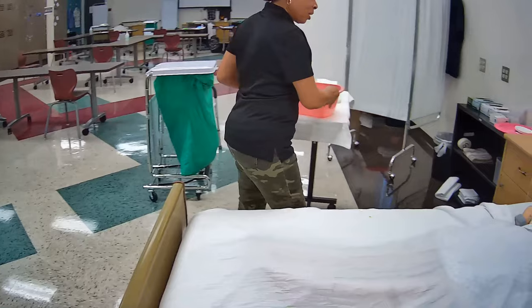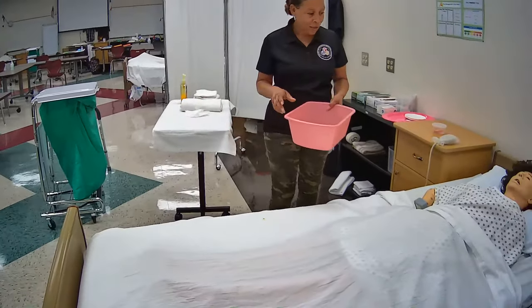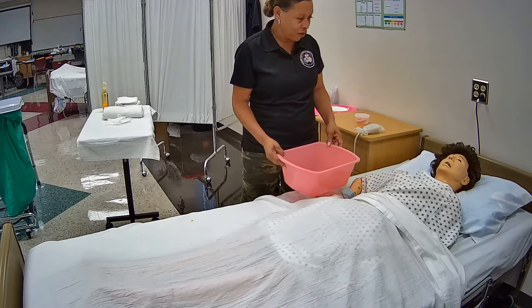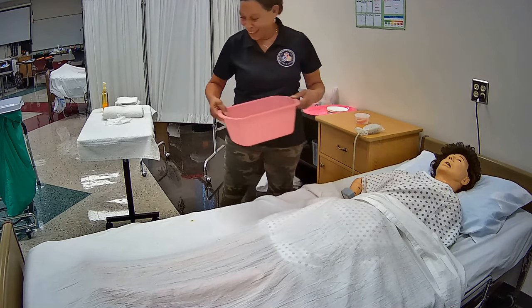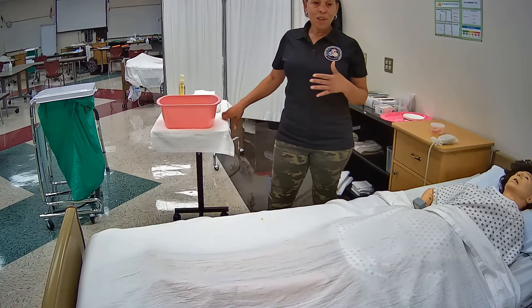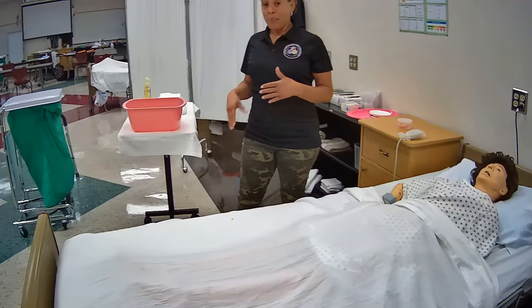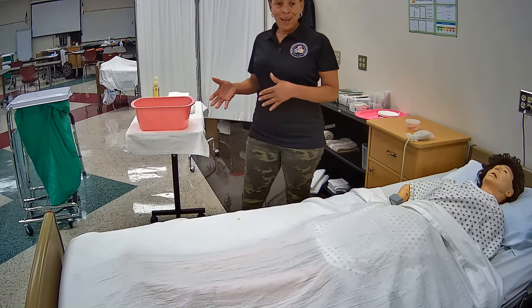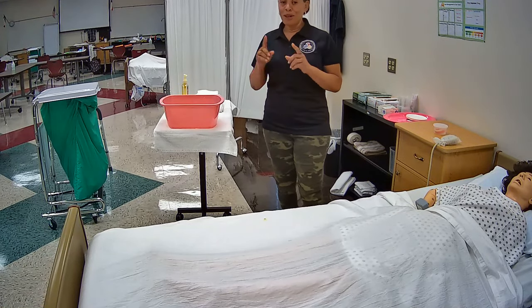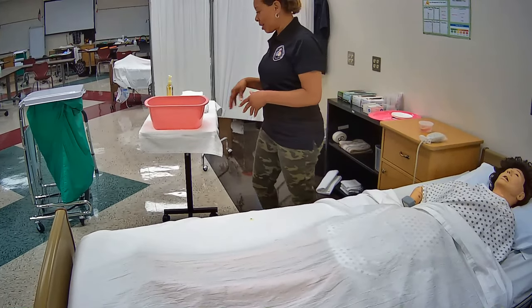Hi Mrs. Jones, it's me Julie, your CNA. I've tested the water and it feels good to me, but I would like for you to test it to make sure it's a comfortable level for you. Now, because the NAE or proctor will be speaking for the mannequin and this skill is performed on a mannequin, you will not have to put the mannequin's hand in the water. But remember, you have to test it first and then have the resident test it.